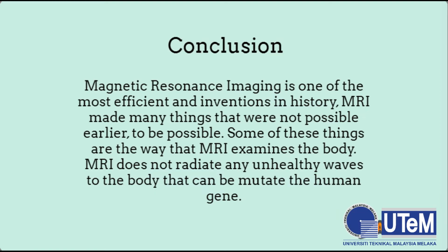Conclusion: magnetic resonance imaging is one of the most efficient inventions in history. MRI made many things possible that were not possible earlier, such as the way it examines the body. MRI does not use any unhealthy waves that can mutate the human gene.